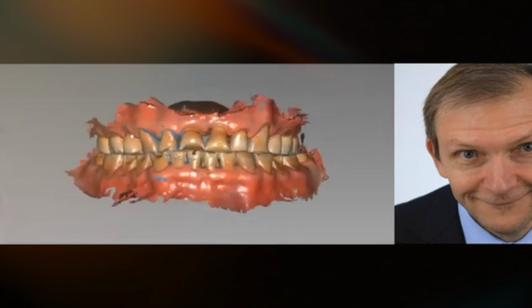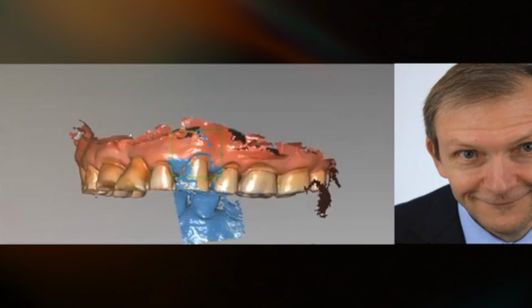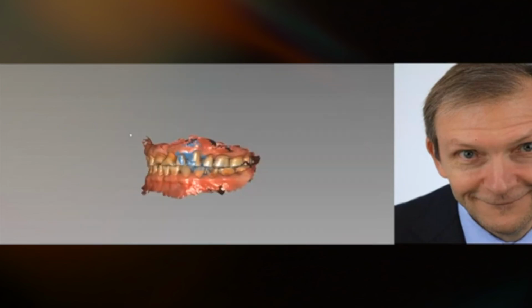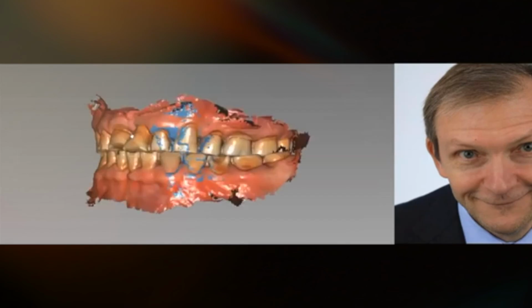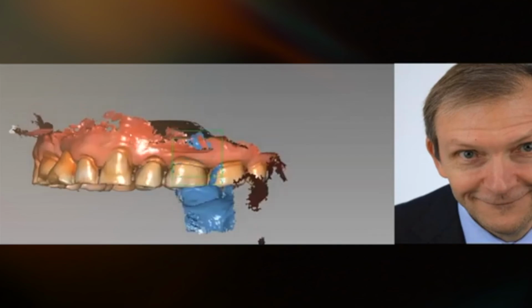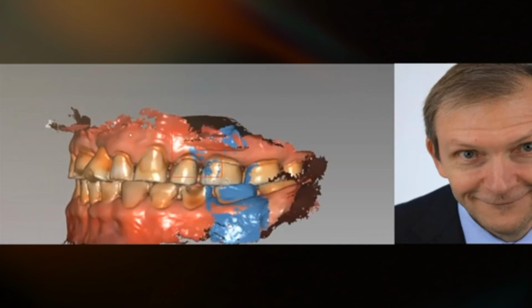And then we get occlusal records. We had prepared incisal guidance in order to verify how much we will increase the occlusal VDO. So we put it in the mouth, on the anterior teeth, and we scan the upper and lower teeth.